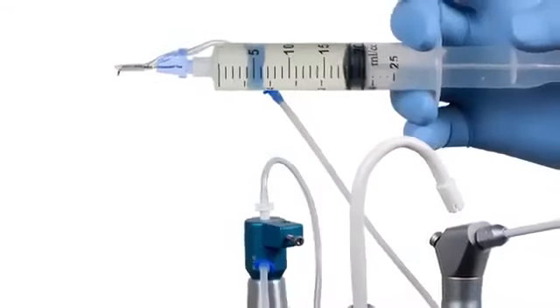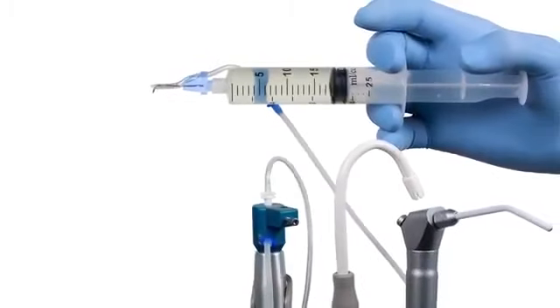Well, Allie, today we're going to talk about EndoVac. EndoVac is an endodontic irrigation system that allows one to flow copious amounts of irrigation through the root canal system. Now, we know from science that the cleaning and shaping process only goes so far when it comes to cleaning the canal. So what EndoVac does is it takes it beyond the cleaning and shaping process and actually irrigates. We found it'll do up to 300 times a minute. So we'll circulate that fluid 300 times per minute. And what that does is it takes the debris remaining from the cleaning and shaping process, as well as the parts of the canal that the root canal instrument simply can't touch.